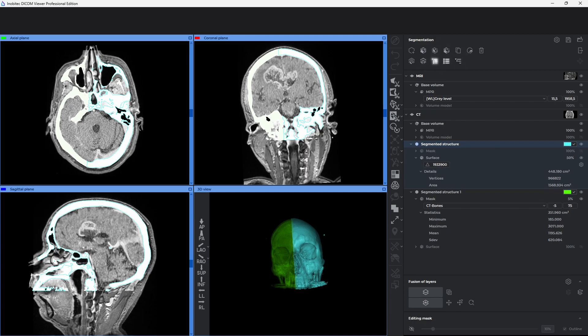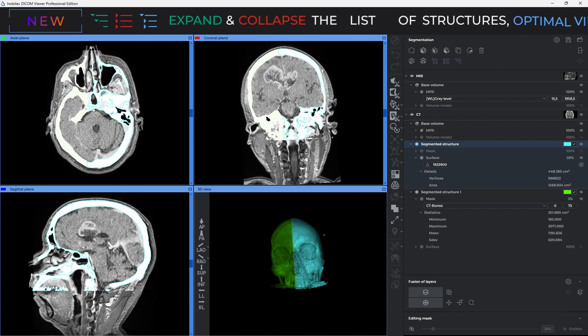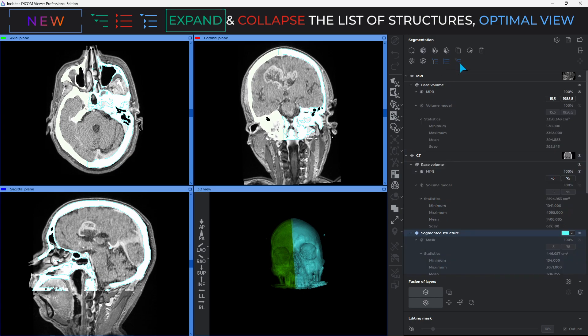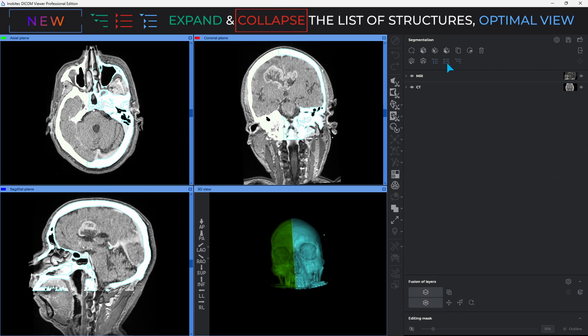Now let's take a look at the new tools for managing the structures list. The Expand All button unfolds all hidden elements of the structures list on the segmentation panel. By clicking Collapse All, the segmentation panel hides all list elements.